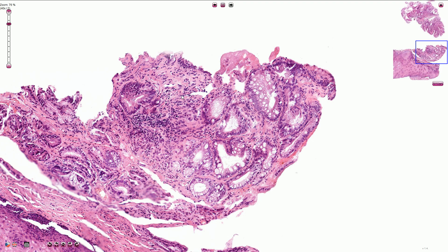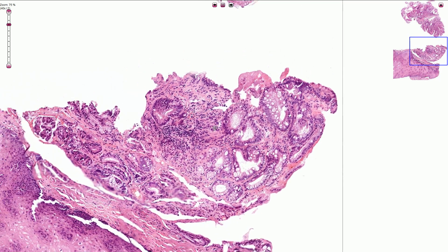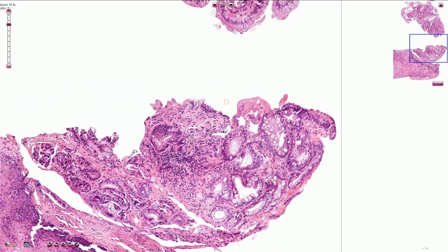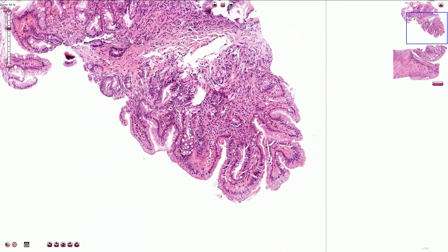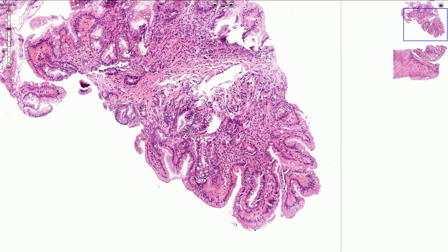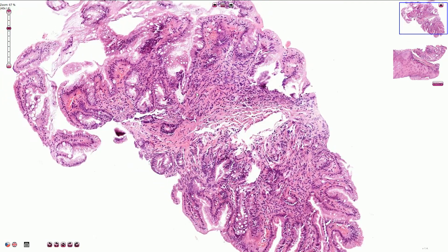Barrett's esophagus is not a purely histological diagnosis. We need to correlate the presence of intestinal metaplasia with endoscopic findings, mostly because we need to exclude the presence of intestinal metaplasia in the stomach — so-called gastric intestinal metaplasia — which could be associated with H. pylori infection.